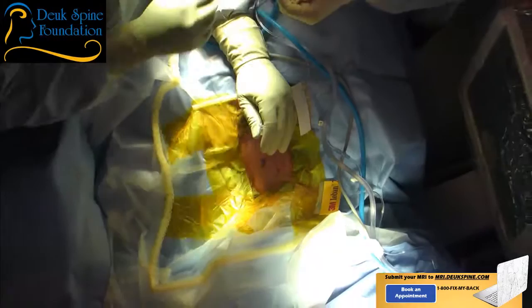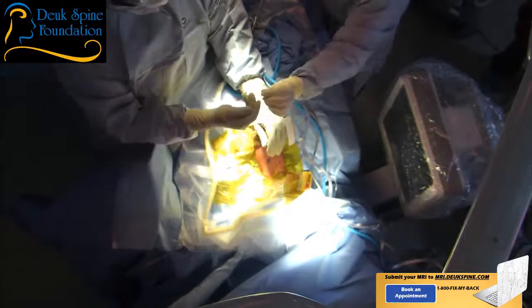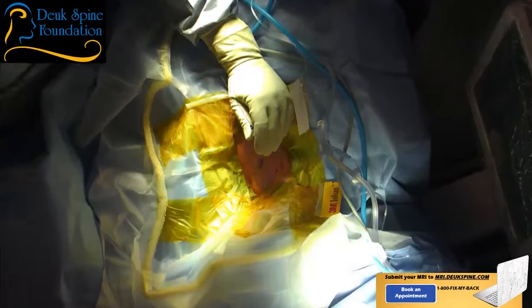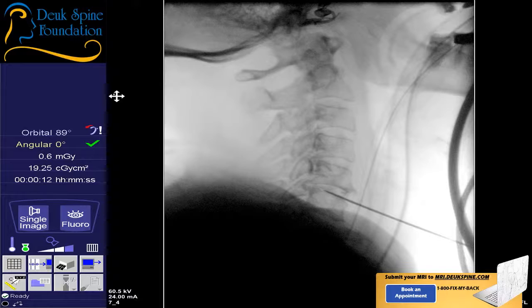Now we're going to place our guide wire, and we're going to use the guide wire to guide my instruments from out here where we are to the herniation safely. The key word is safely. That's what guide wires allow — they allow a safe movement of surgical instruments to the parts of the body that we need to operate on.